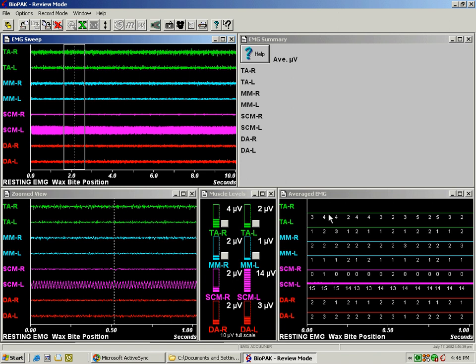Now what we're going to do first of all in review of resting muscle activity is to check for background electrical noise. Electromyography measures the electrical activity of muscles, and in doing so may pick up extraneous electrical noise.